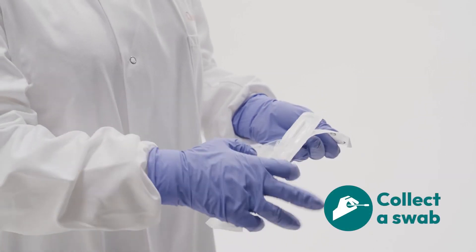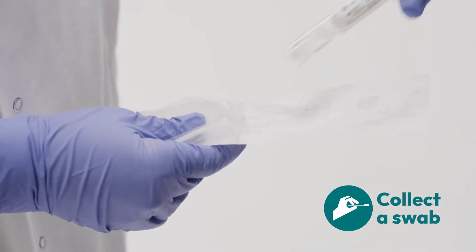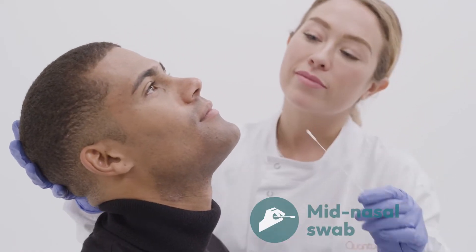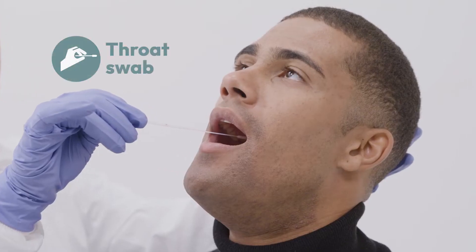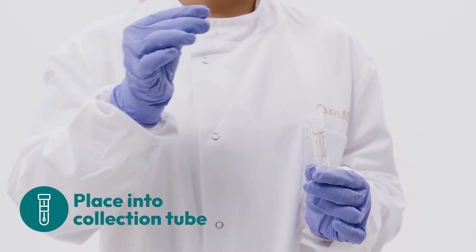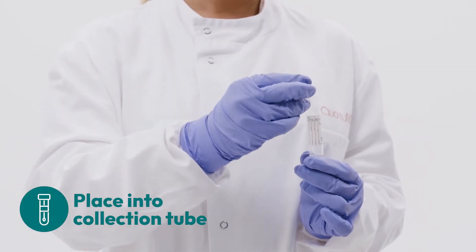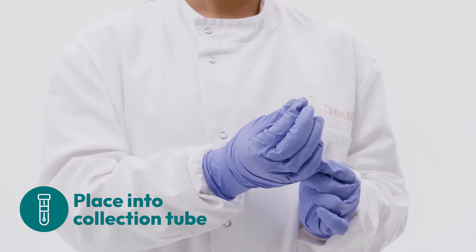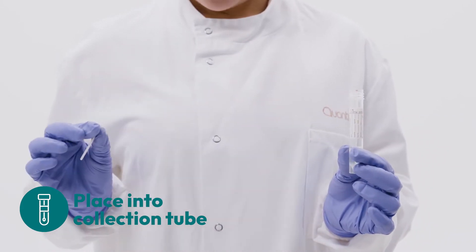Open the kit and remove the swab and the tube. Take the correct specimen type according to the assay instructions. Insert the swab into the tube until the marked break point. Bend and break the swab at the marked point.